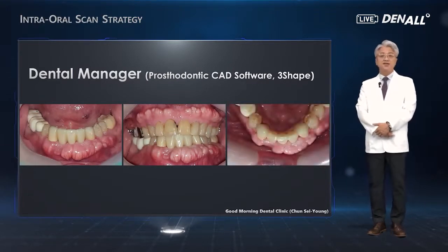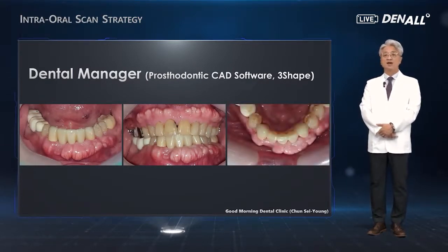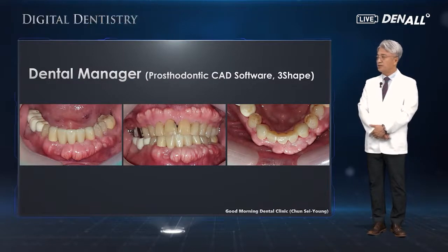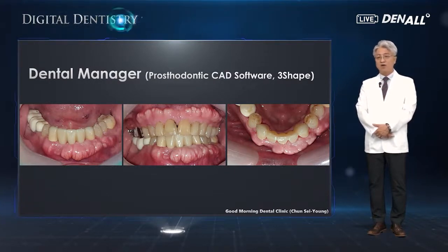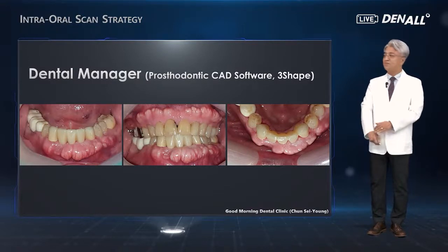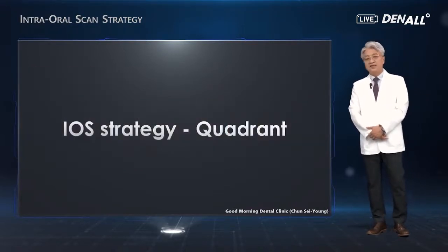Using the modelless approach in our office, designing is done, milling and sintering processes have been conducted, and the prosthesis is delivered to the patient. I cannot say it's a superb prosthesis, but based on my experience, clinically, it doesn't cause discomfort, and it was pretty satisfactory for me and for my patient. The prosthesis was fabricated very easily for the clinical treatment.